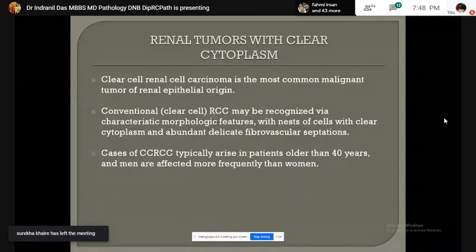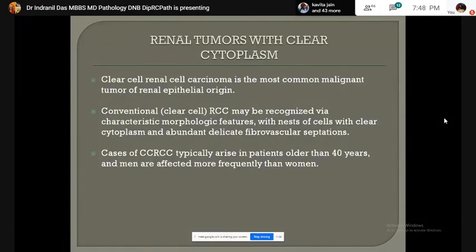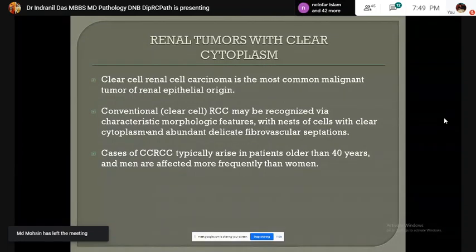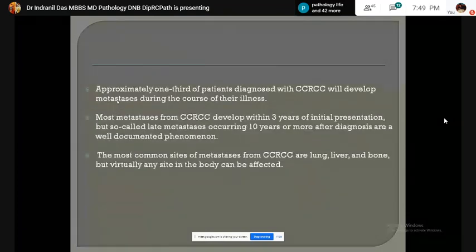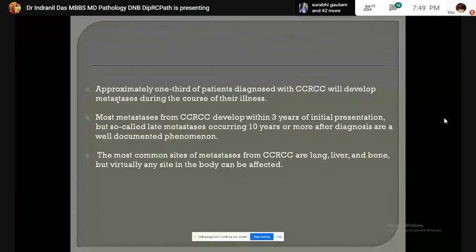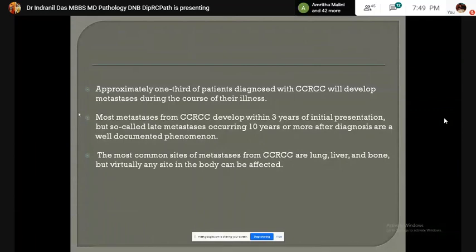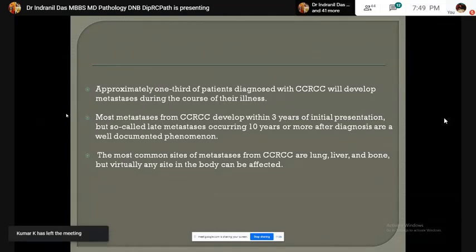Clear cell renal cell carcinoma is the most common malignant tumor of renal epithelial origin. It usually shows nests of clear cells surrounded by abundant thin fibrovascular septa. It usually presents in patients older than 40 years and may affect men more frequently than women. One third of the patients develop metastasis during the course of disease — some within 3 years of onset, some even after 10 years. The most common sites of metastasis are lung, liver, and bone, but virtually any site in the body can be affected.